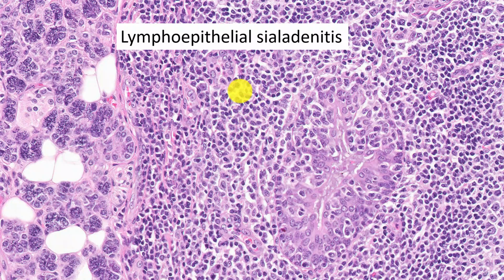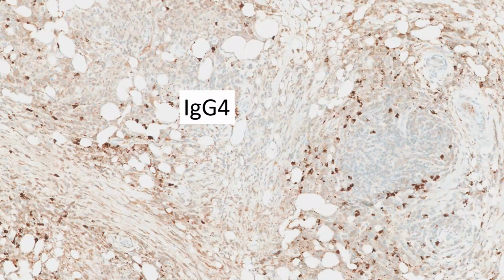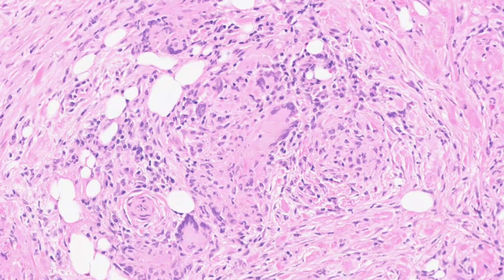So with IgG4-related disease, you do not see lymphoepithelial sialadenitis, although when you see something like this, you must consider a lymphoma, and then your hematopathologist becomes your closest friend. Here's another parotid mass, and now I'm looking at storiform type fibrosis, right? So here's the center, here are the spokes. Pathology is, as I say to some of my residents, the art of the imagination, right? You gotta have some imagination, and if you imagine just right, you will see the storiform type fibrosis. There was a substantial increase in IgG4 positive plasma cells. I am not a counter, but I counted about 100 per high power field.